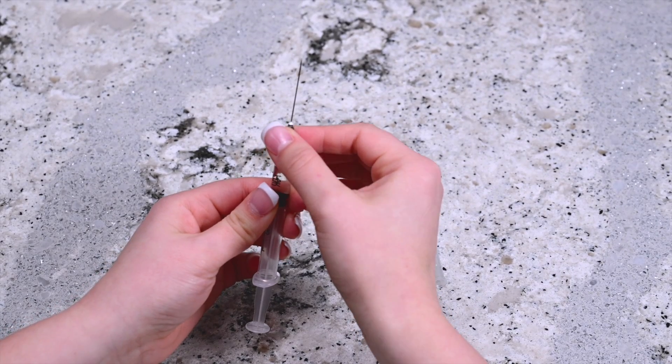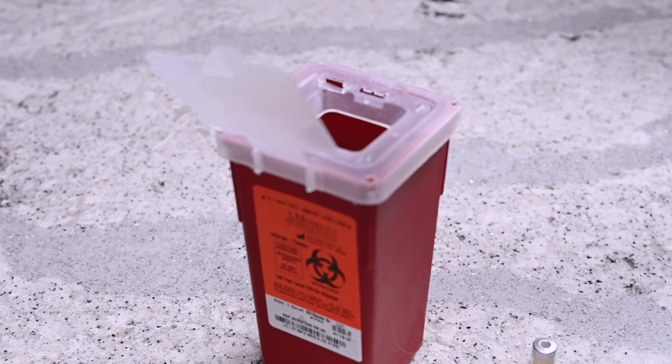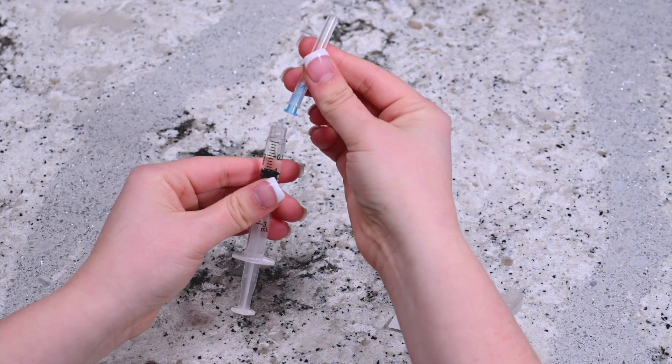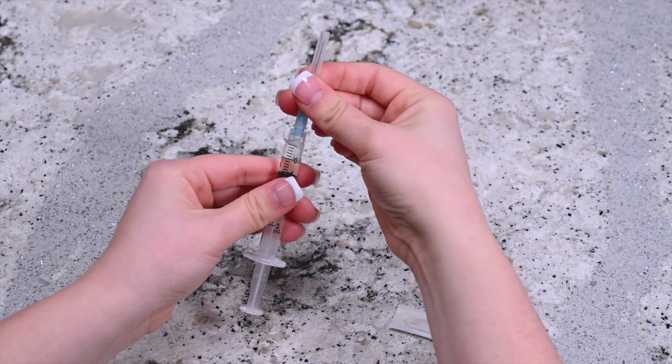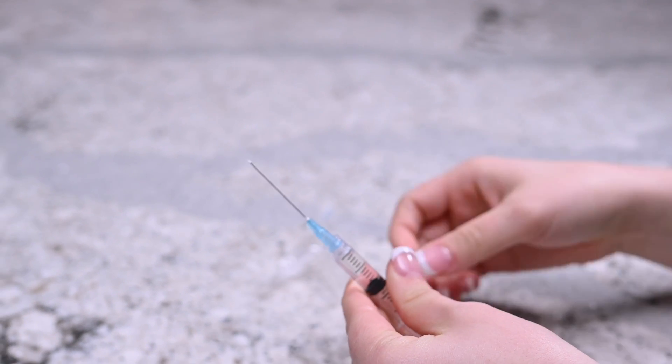Remove the mixing needle by twisting it off the syringe and placing it in the sharps container. Remove the injection needle from its packaging and twist it into place on the top of the syringe. Hold the needle upright and remove the cap.